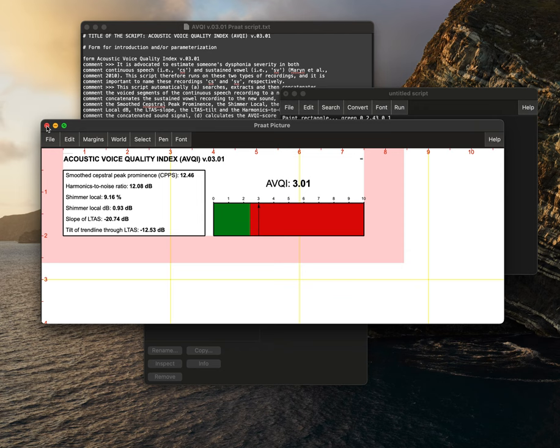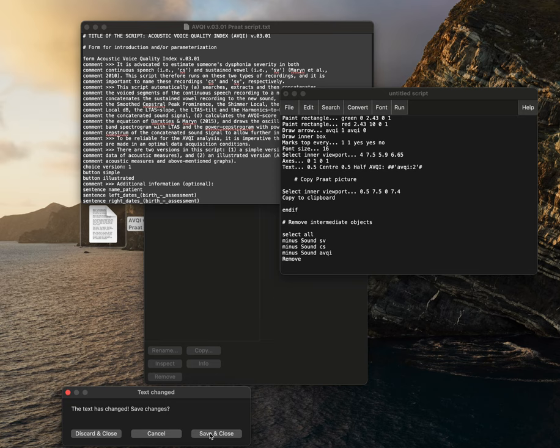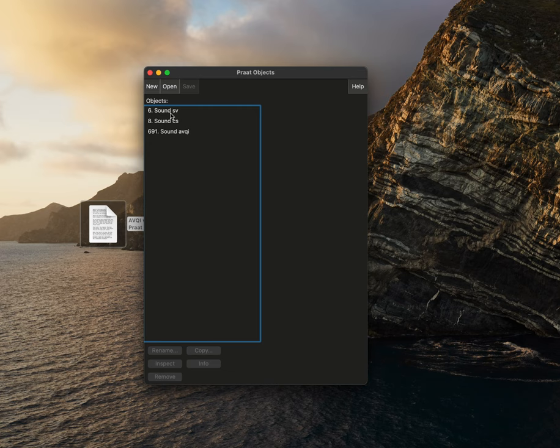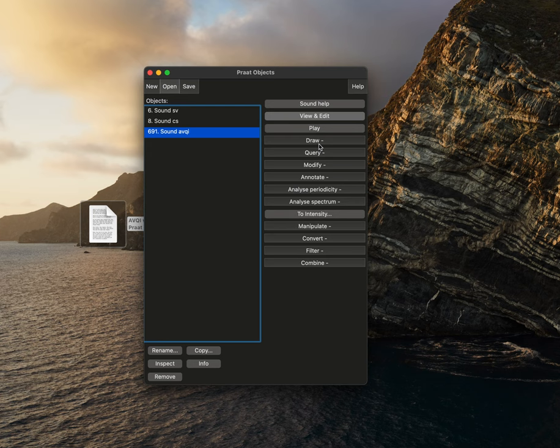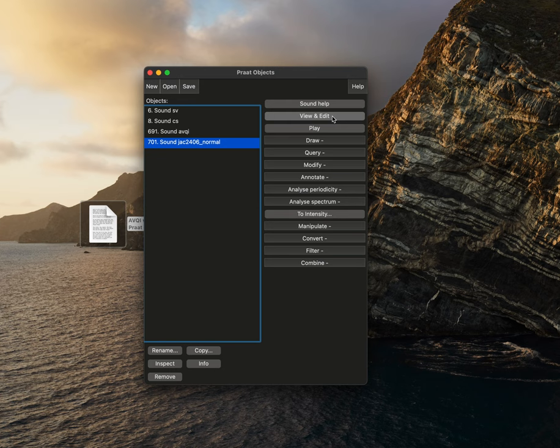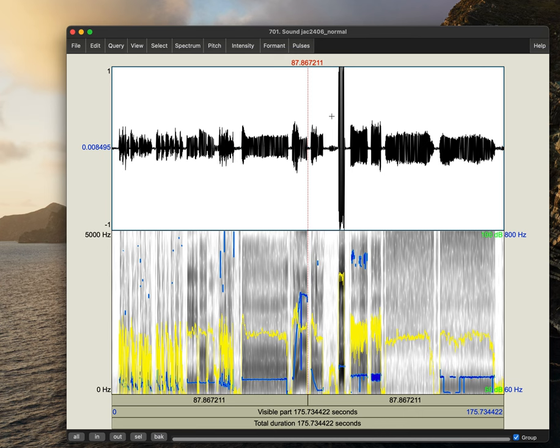we might be interested in using Praat to help analyze our maximum phonation time, our S to Z ratio, and our laryngeal DDKs. So you'll open up your WAV file that you previously created, view and edit. So these are not things you have to do on Praat, but I find them to be very helpful. Not only is it more reliable, but it's actually quicker than just trying to listen.